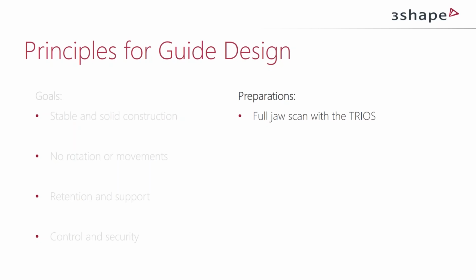So we have made a series of videos where we showed to trios users how to scan for surgical guides for different clinical conditions, in available space, but also future position of the implant, and what to consider when taking the scan on how much of the supporting gingiva needs to be scanned and which strategy and way.